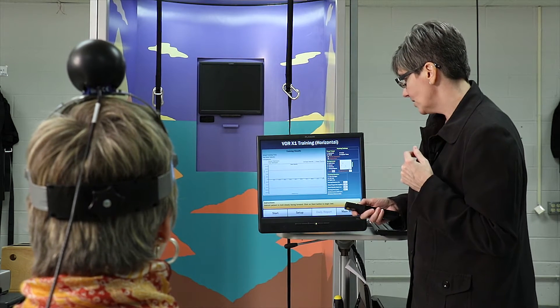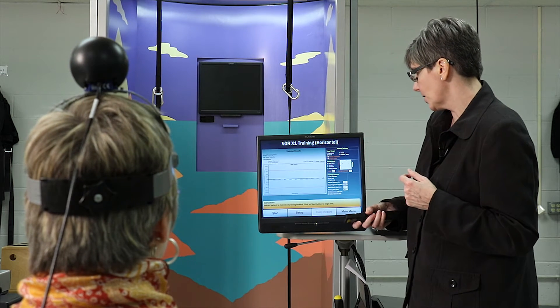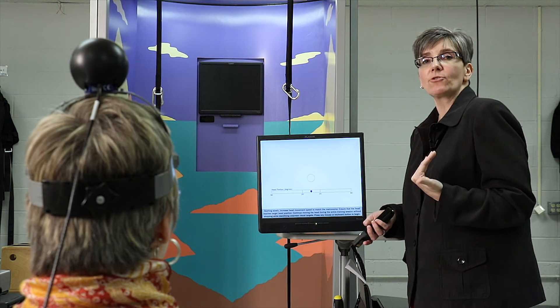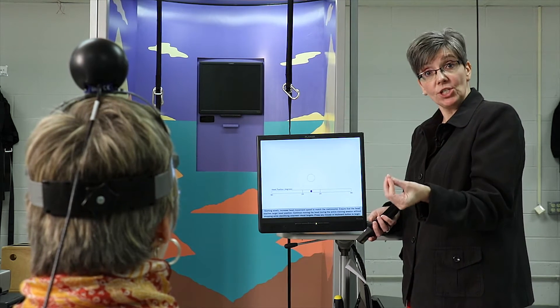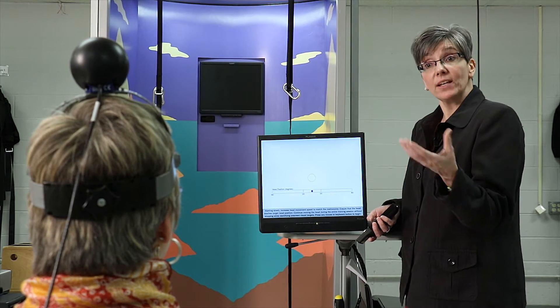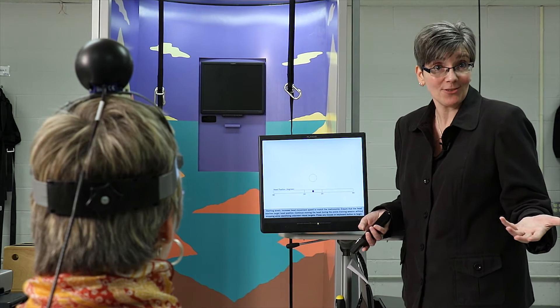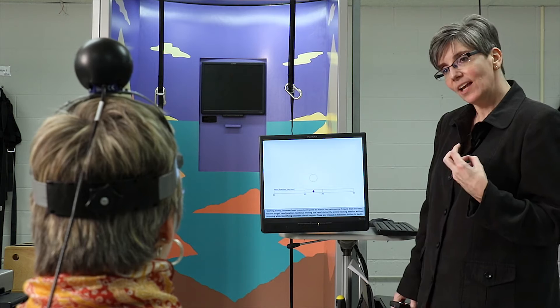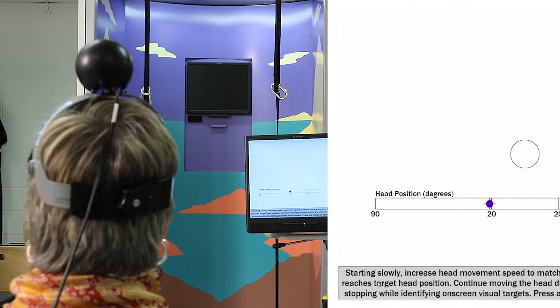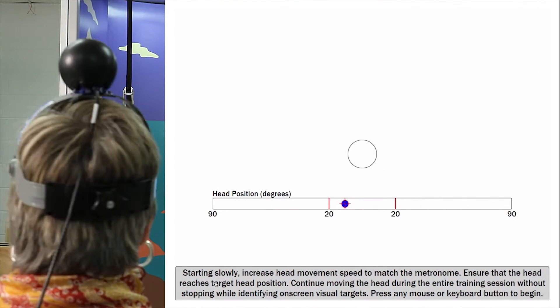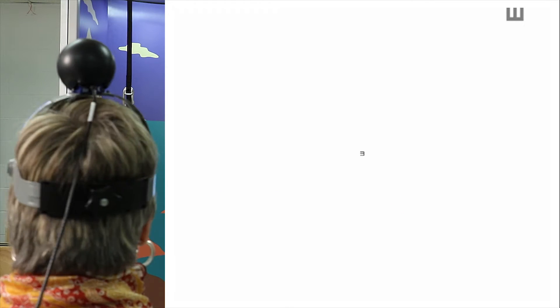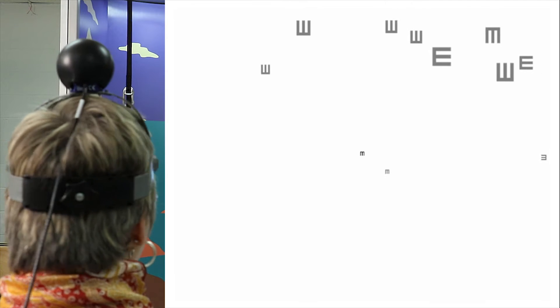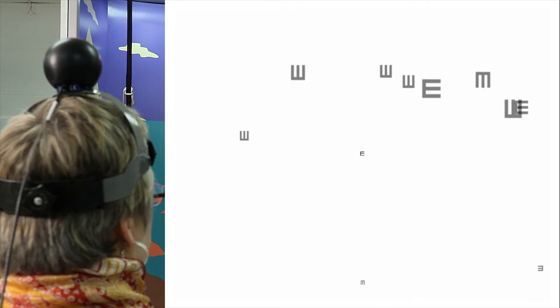Mary, are you ready to do some training? When I click the start button, the ping you hear is the metronome — the same speed at which she would do this exercise at home. If she has a metronome app on her phone, she can do this exercise at home at the right speed. Here are your distance markers, Mary — hit each marker to the beat of the metronome. I want her to do this exercise for 60 to 90 seconds.